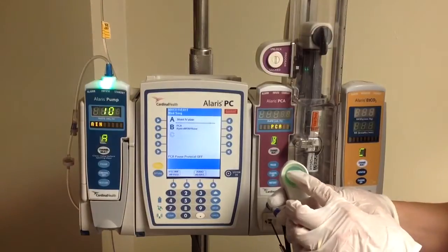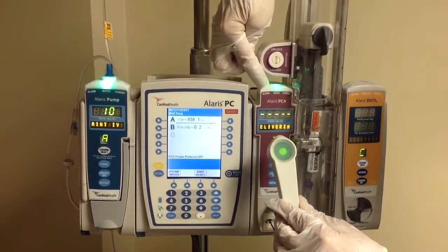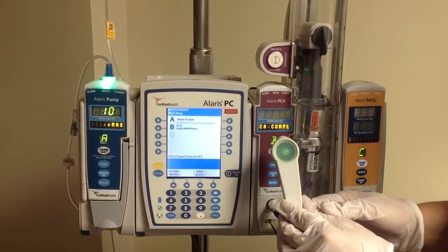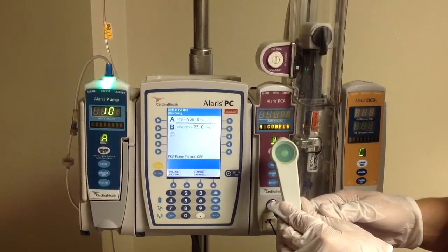When the patient pushes the button, it's going to start blinking, and you're going to notice on the top of your lighthouse there that the infused green light is on. It's going to stay green until the dose is delivered, and now the light is out.